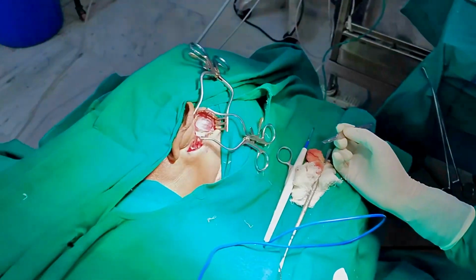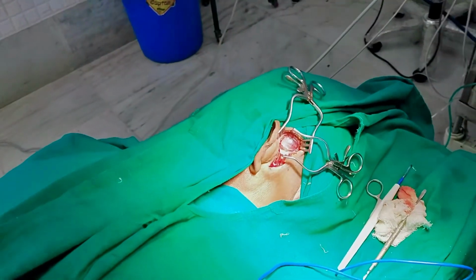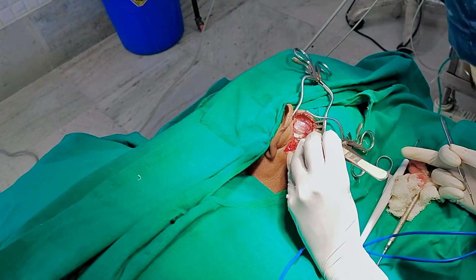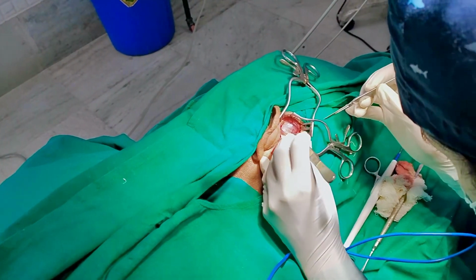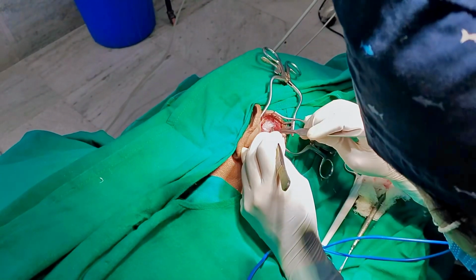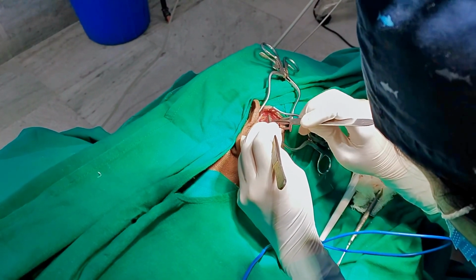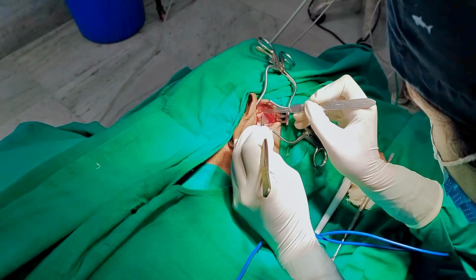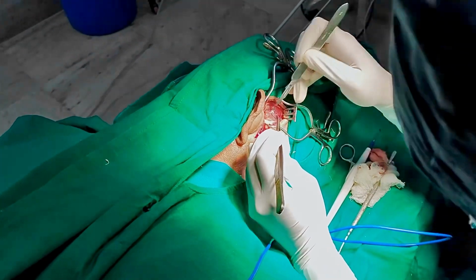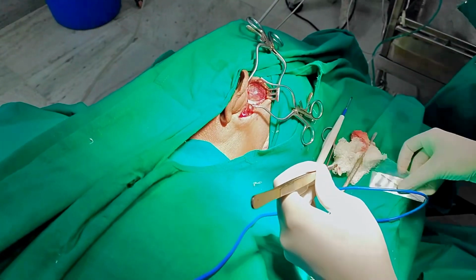Now as you can see, it is being pointed out that the temporalis fascia is totally separate from the muscle. We basically have to take it up from the muscle. And the anesthesia used here, since this is an adult patient, is local anesthesia. In case of children, we have to go for general anesthesia. Now I am not showing anything that we do in the middle ear, because that is a little more difficult to understand at the UG level. So only the collection of the temporalis fascia has been shown.